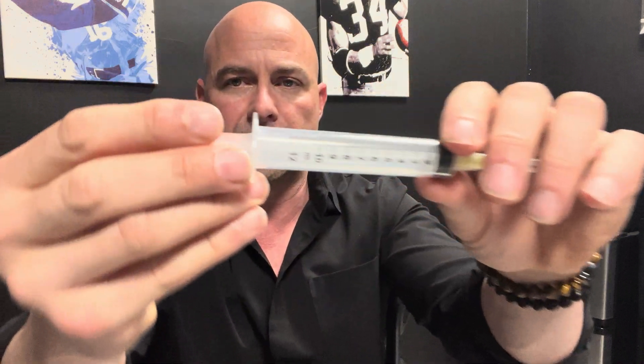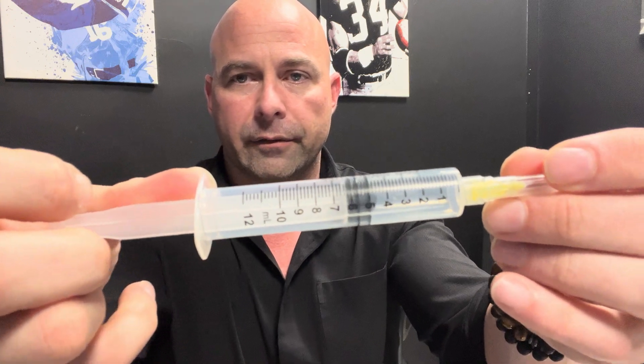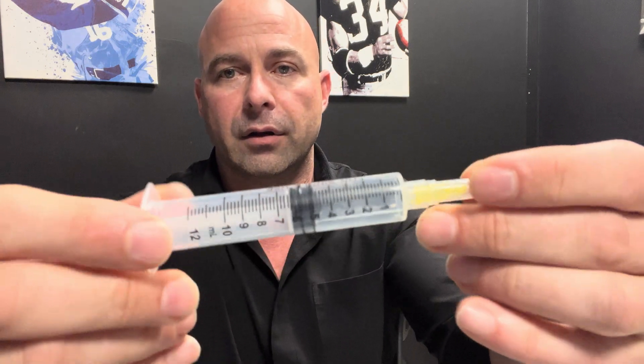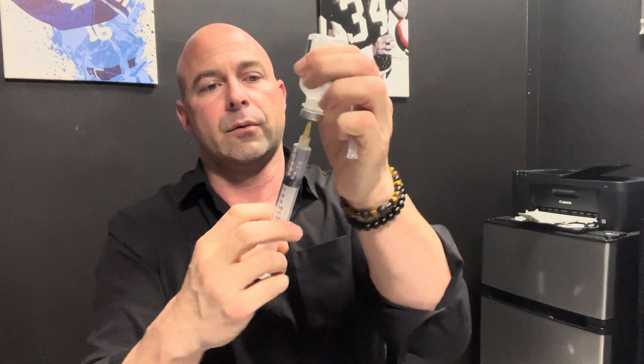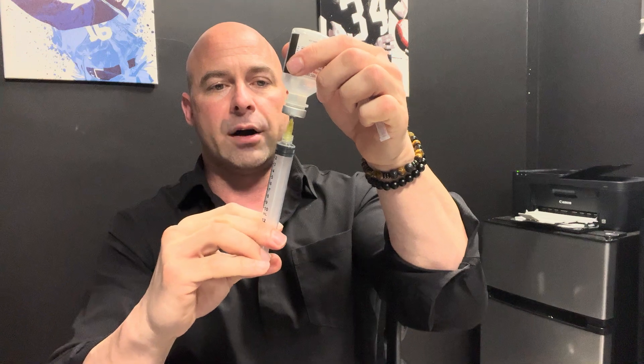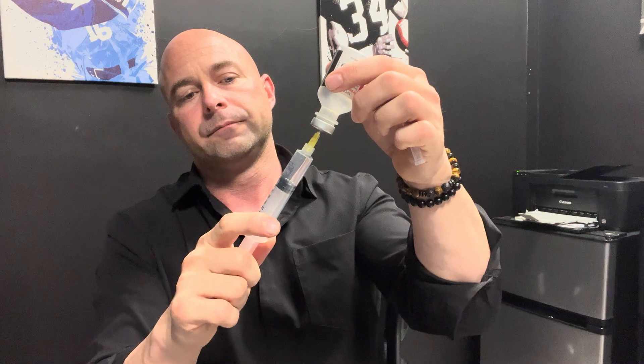This is a 10 to 12 milliliter syringe — if you look closely it goes up to 12. What we're going to do is pull it back to the five for air, then get our water, turn it upside down, take off the cap, and inject. Look — it just sort of pulls right back on its own to the five. That's what we want, right there at the five.